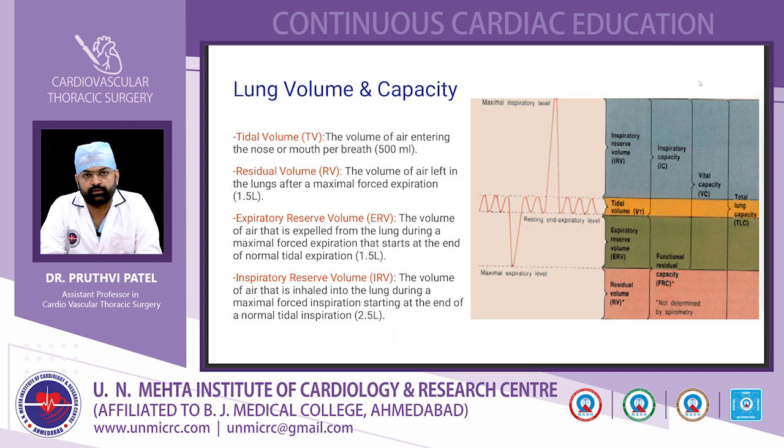So we go back to physiology. There are 4 volumes and 4 capacities in this test. This is mainly showing, the first one is tidal volume, the volume of air entering the nose or mouth per breath. In a normal adult individual, it is 500 ml.